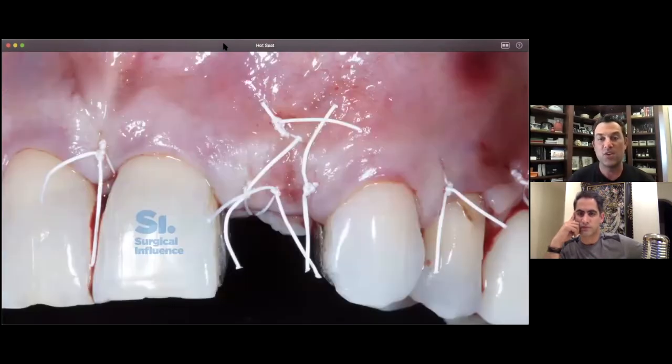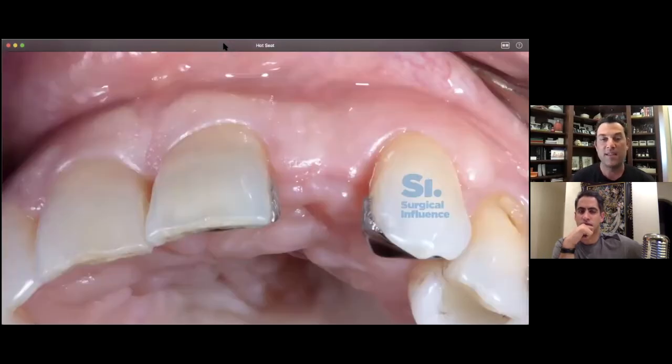This case healed very well with good turnover of the bone graft because we were able to get it so secure. You can see just how taut that membrane looks, encasing the bone graft. Getting primary closure is critical — we don't want to lose bone graft materials or have our membrane exposed, because exposed membranes break down quicker. I follow the Rhonda article which describes a single shallow periosteal releasing incision with stretching within that incision line — that was a real game changer for me, replacing the blind incisions I was taught in training.